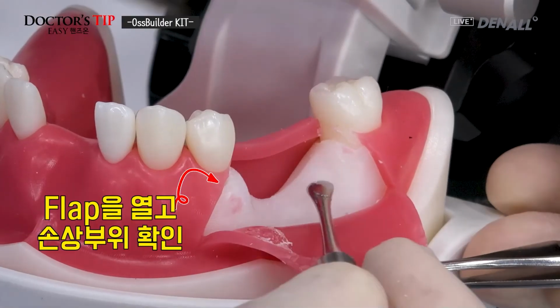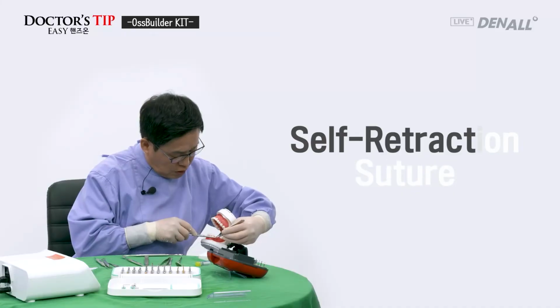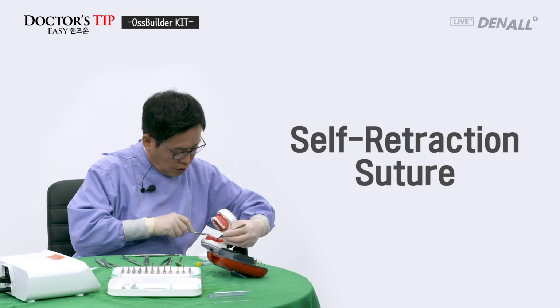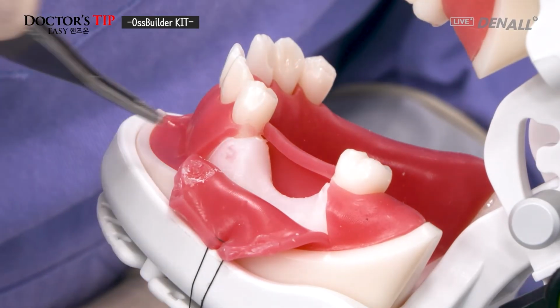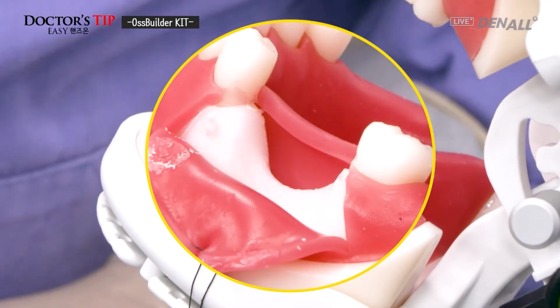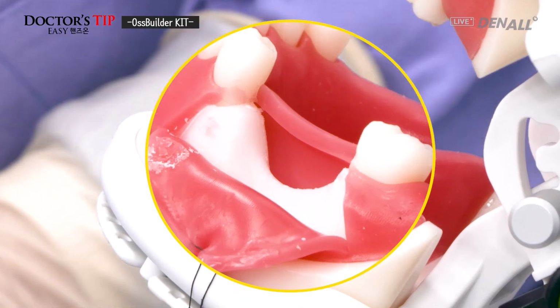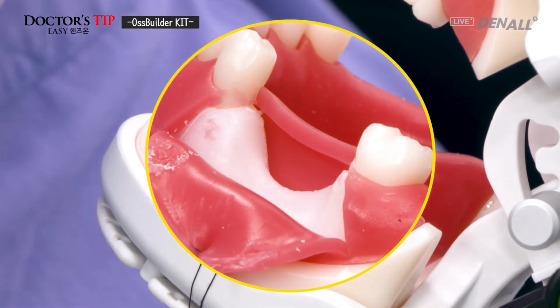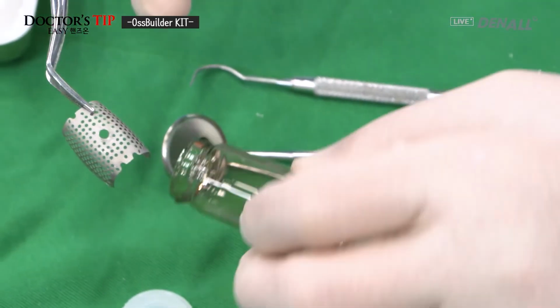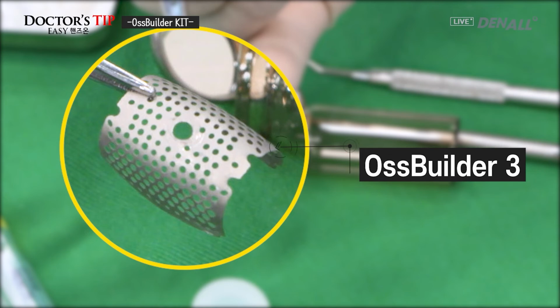The model has a severe atrophy. The mucosa, I'm going to do tagging suture. As you can see, the defect is huge. If implant placement is very difficult, using OssBuilder 3. I'm using OssBuilder 3 at this point.